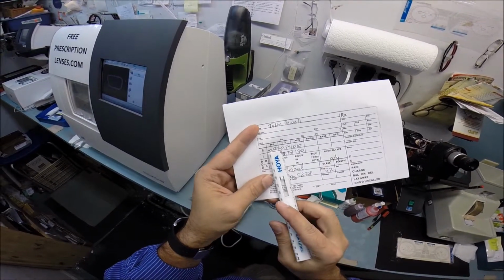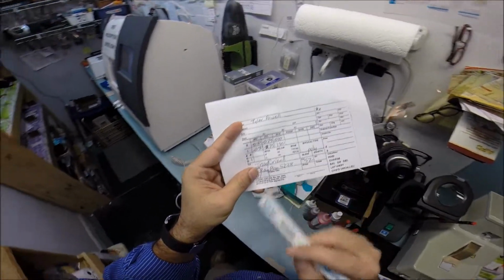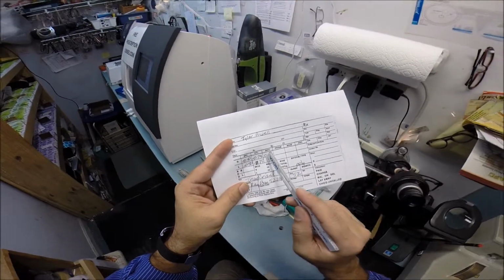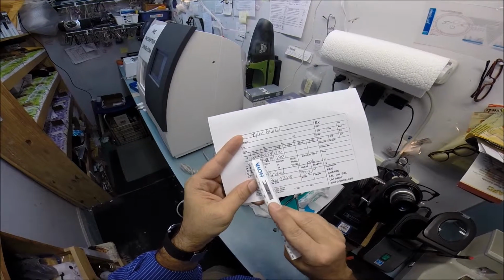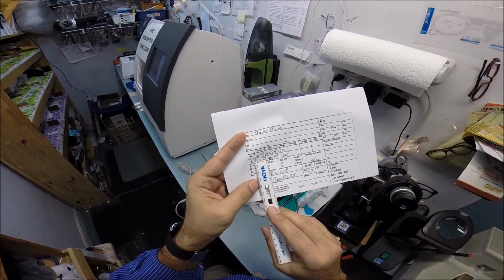You need 2 steps of minification in your right eye. In fact, your eyes are the same. They are OU, which means the same in both eyes up to the axes. You need 2 steps of correction for your right eye, 2 steps of minification as well for your left eye.